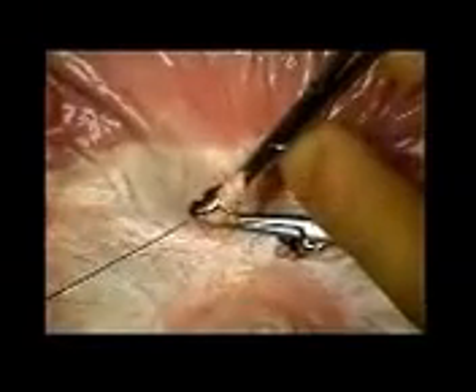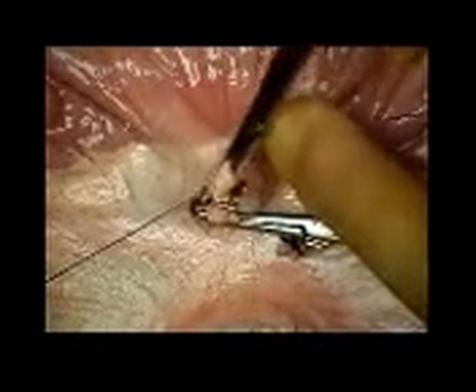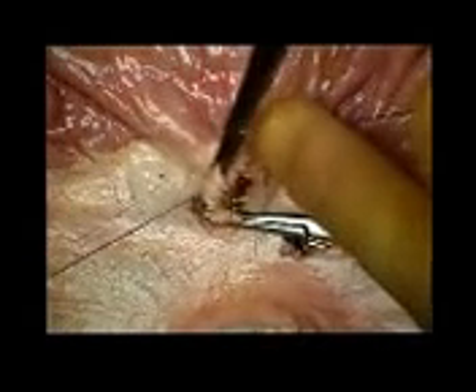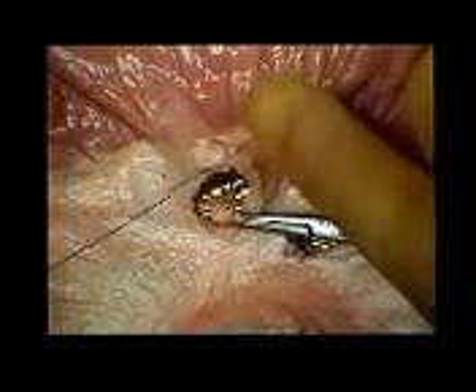Starting with the threads crossed, form a backhand throw so that the index finger will come down to slide the knot into place and adjust the tension. The assistant then releases the hemostat to prevent the tissue bunching up. The knot is then completed with three or four more throws using the method previously described.